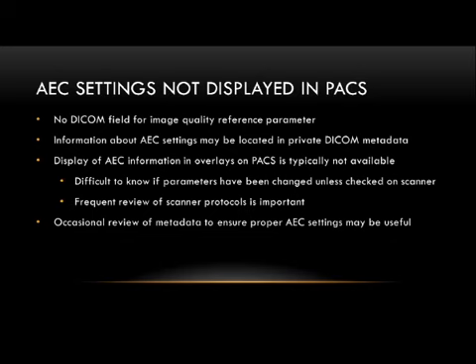So I think that speaks to the importance of frequently reviewing the protocols on the scanners, and for the CT operators to make sure that the parameters set when you're about to scan match the actual master protocol. Not just hit the button and scan, but confirm that it matches the master protocol.